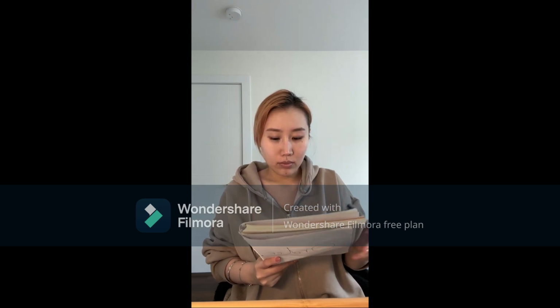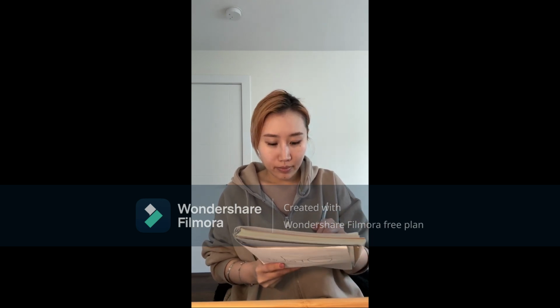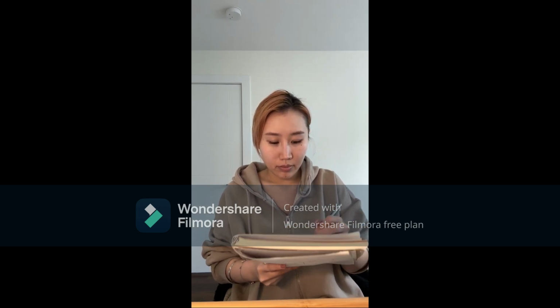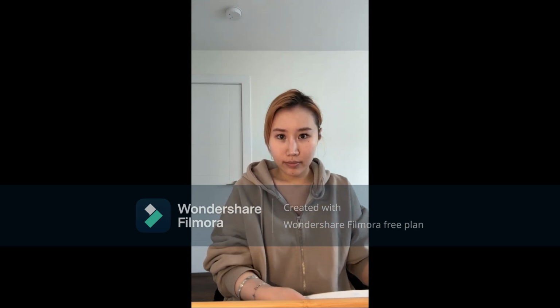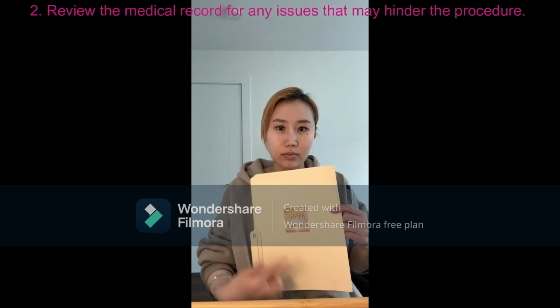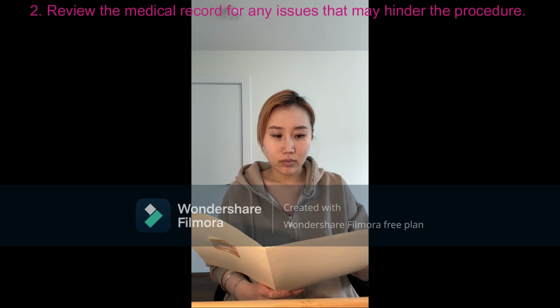So today we have Mrs. P. She recently underwent bladder surgery and was ordered a Foley catheter. We checked the doctor's order and made sure it was accurate. It is also important to review the patient's medical record to identify any issues that may affect the procedure.